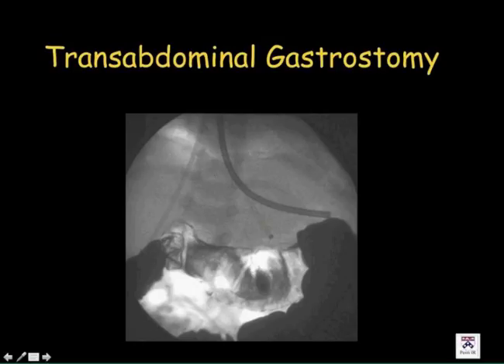In Children's Hospital, because the distances are so small, I'm talking about newborns or even preemies, we usually mark the spleen, we mark the liver with ultrasound, so we see the window. Then on the table, we give them an enema to decompress the colon. Usually we put two tubes inside, one to inflate the stomach and one lasso. You will see in a second.